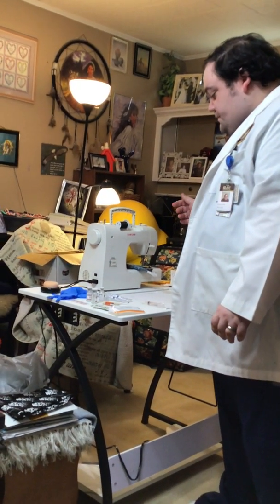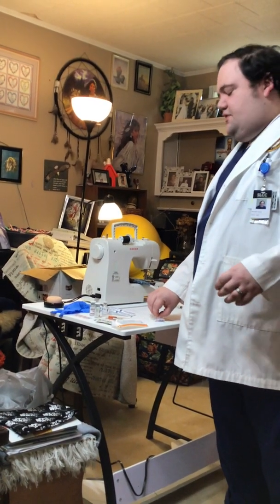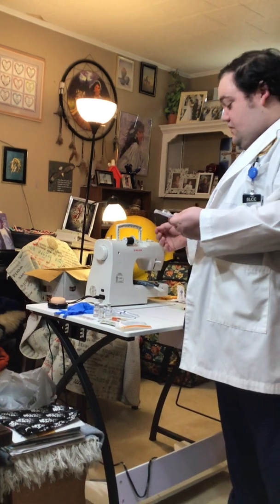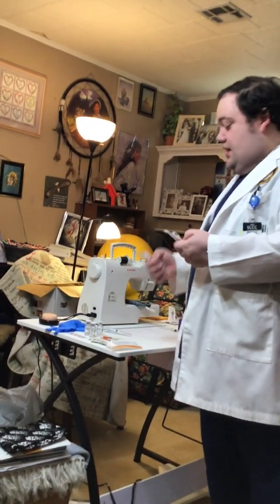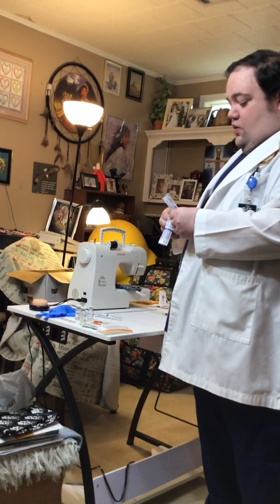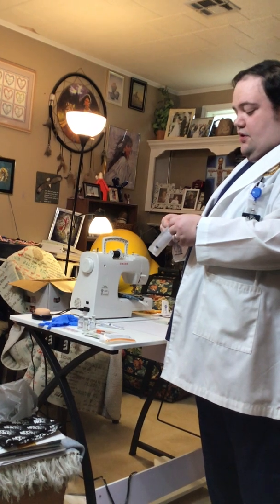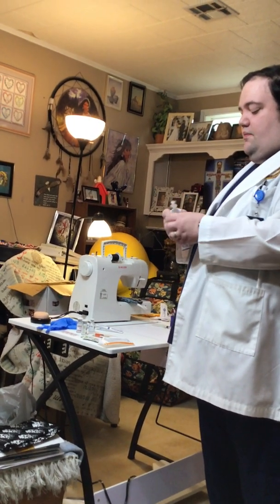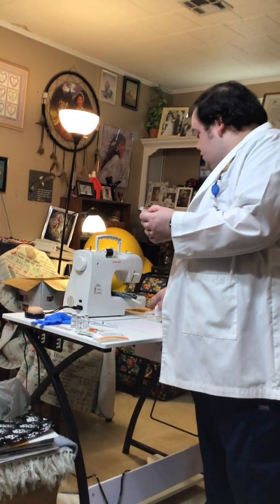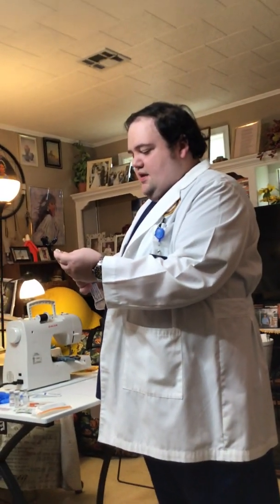Okay. The next injection that our provider has prescribed is dexamethasone. Dexamethasone is a steroid. And so what we're going to do is prepare our needle. We're going to use a 3 cc, a 3 milliliter syringe. And the same thing applies. We're not going to break any type of sterility.